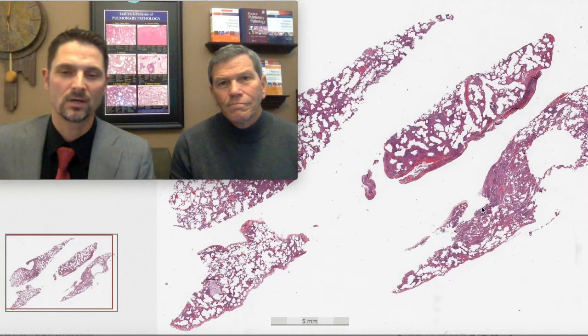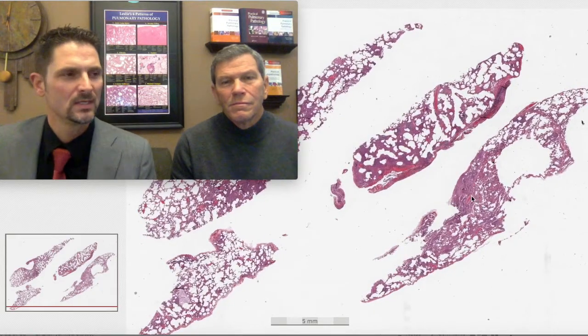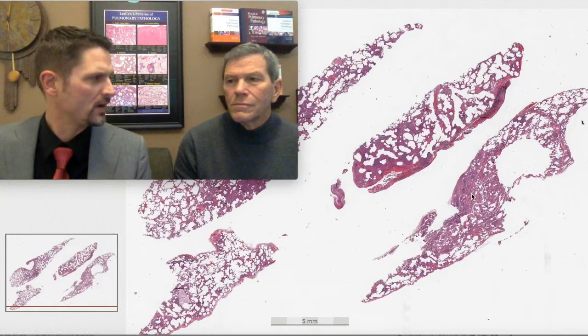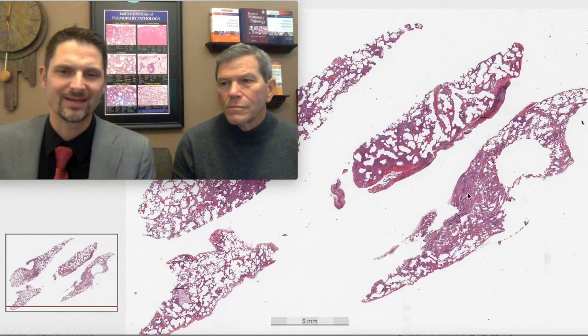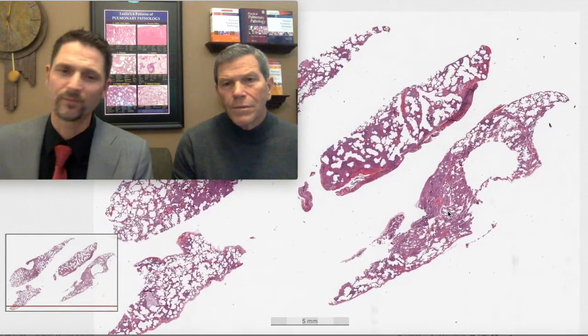And this is another one in our series of the top 25 pearls of pulmonary pathology. And we're in the topic about the importance of clinical and radiologic correlation and how that can impact your pathologic interpretation and diagnosis. So we've got a case for you.